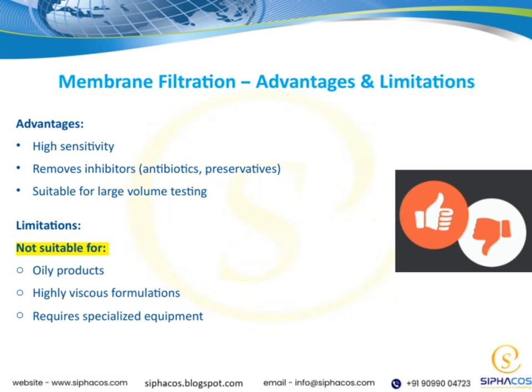Now, turning to the limitations, there are some types of products where membrane filtration isn't ideal. For example, oily products and highly viscous formulations can pose challenges because they don't pass through the membranes easily or uniformly. Another important point is that membrane filtration requires specialized equipment, so it's not always practical in every setting. Recognizing these limitations helps us decide when this technique is most appropriate within our overall testing strategies.